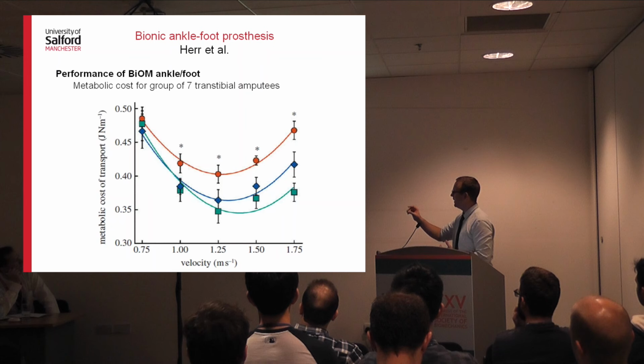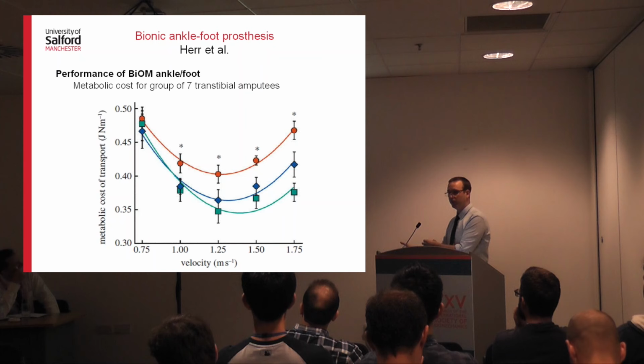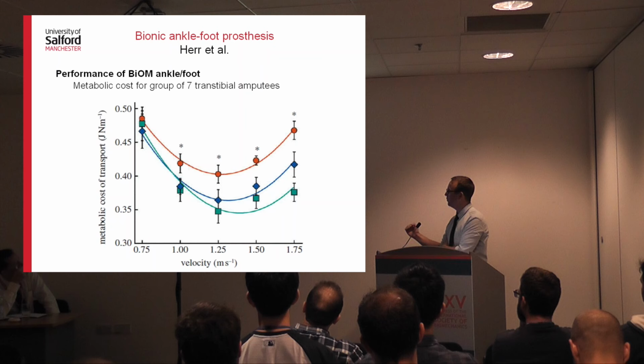And what he showed is their foot, although it's a powered foot, so it's not passive, it has a battery and it has a motor, one of the things it does is it restores that push-off power. And when you compare the metabolic cost of amputees using that foot with non-amputees, the results are not statistically significantly different, i.e. the amputees are being brought back from where they would be with a red line if they were walking with a typical ESR or other prosthetic foot. They're being brought back much more in line with the cost of transport for non-amputees.